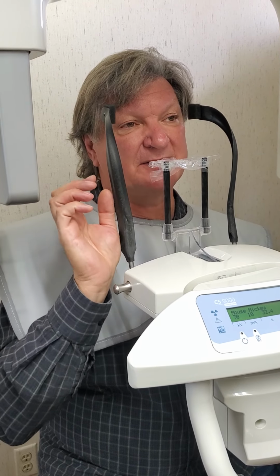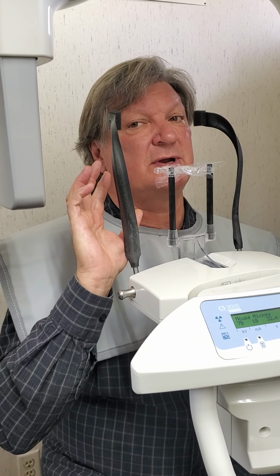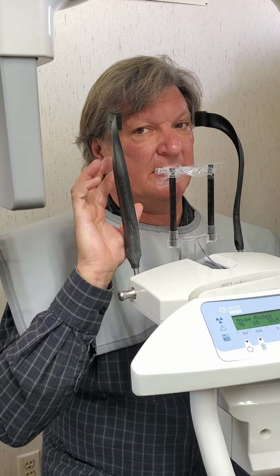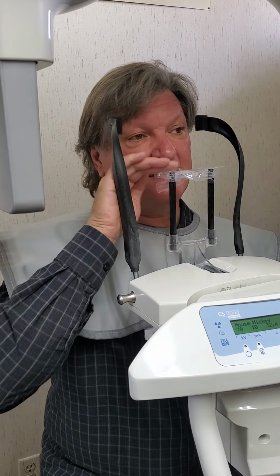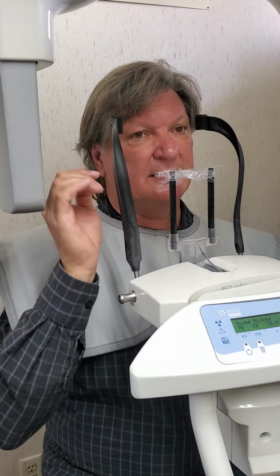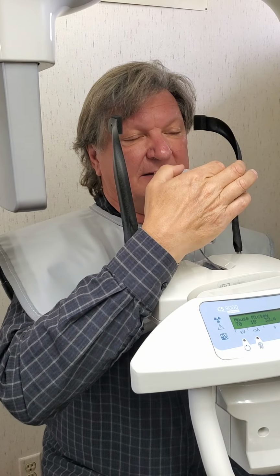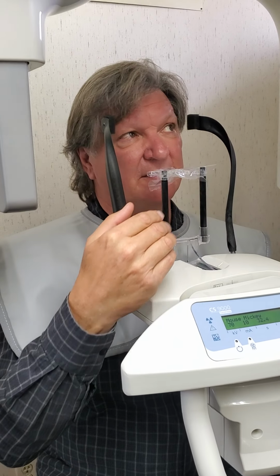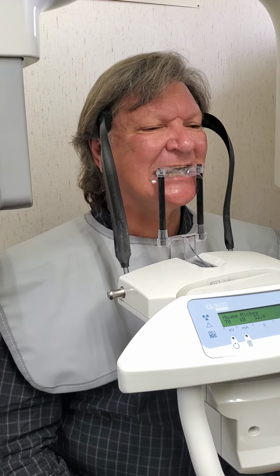Okay. But when I first bite, my head's back a little bit, and it's just my back teeth on the tray, and then I move forward a little bit, and that makes my front teeth come back down. Because we're trying to get everything parallel with the floor, as many teeth as we can, back teeth and front teeth touching. In my case, my canines will touch, and my incisors, I don't feel them touching. They must be close.